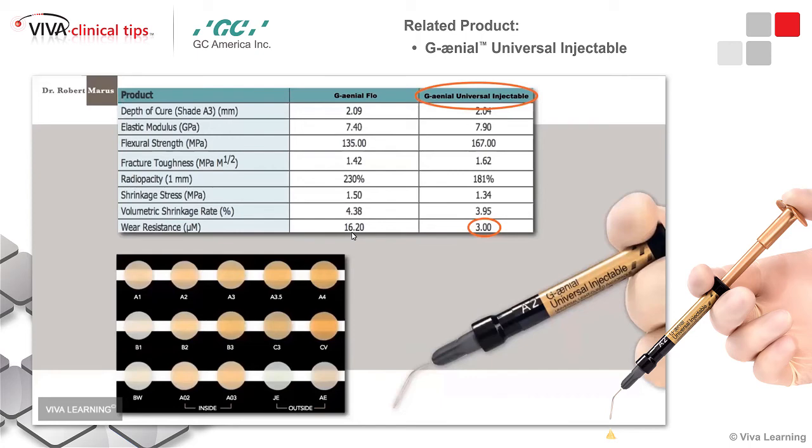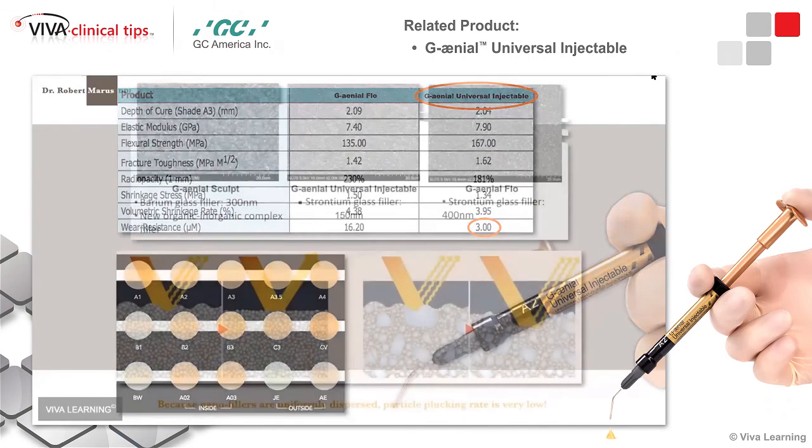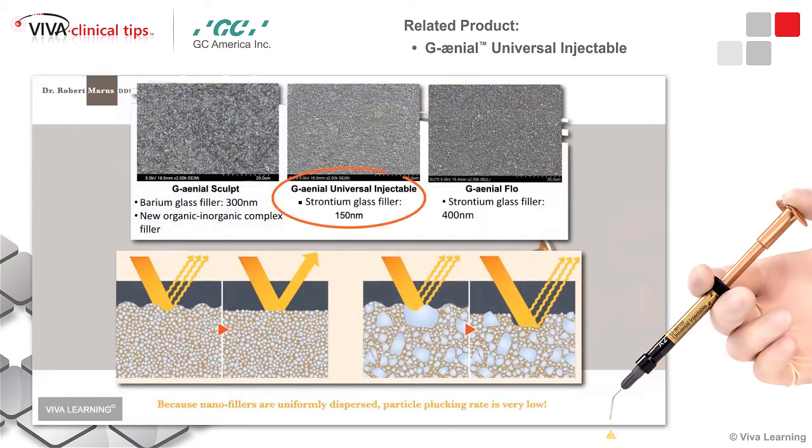This is a very different situation. Think of it as your traditional condensable, compactable composite in a syringe. That's the best way to think of this conceptually. And it's different from flowable in that regard. Comes in all shades, as a matter of fact, and opaque shades.